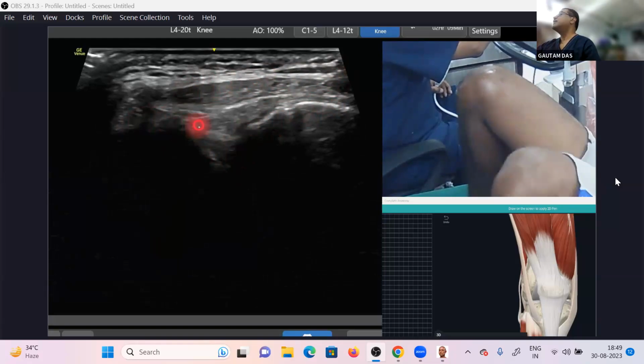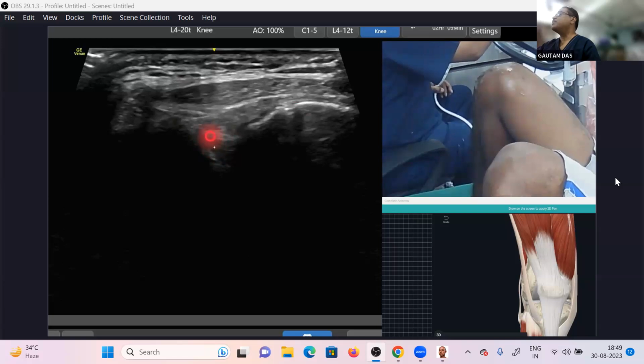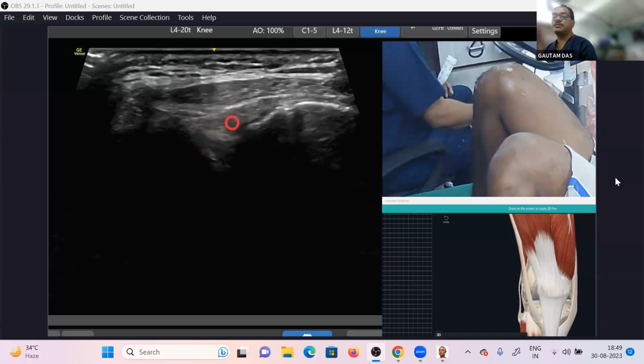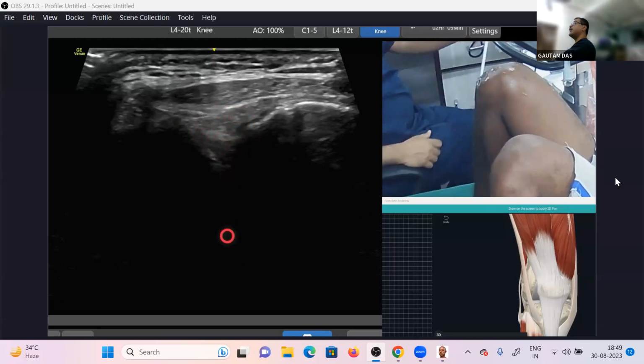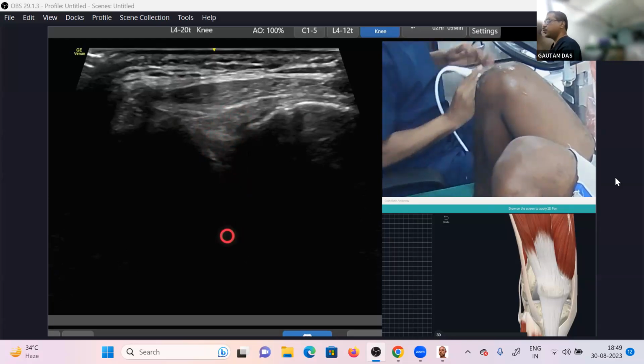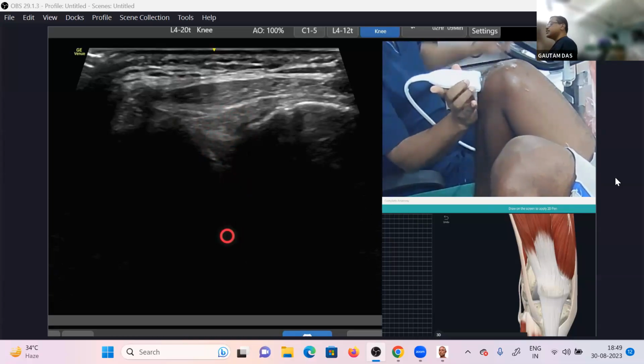And after that, this is your transverse meniscal ligament, and this hyperechoic structure. It's not only one part that is seen; there is a little bit more part here. So this part that is seen very hyperechoic is your posterolateral part. Normally both cannot be seen hyperechoic together. So here you can see the posterolateral part, and the anteromedial part will be here. I'm showing you again, and I'll be tilting the probe, and you try to understand both parts of this ACL, anteromedial and posterolateral.